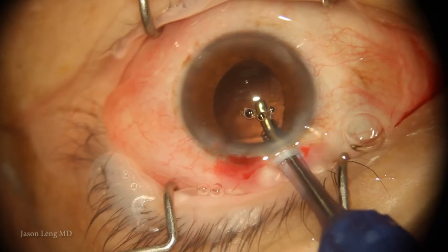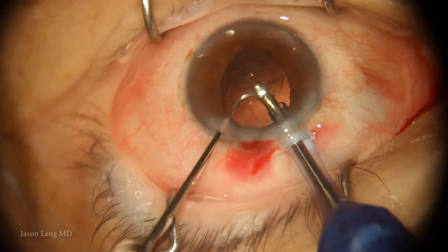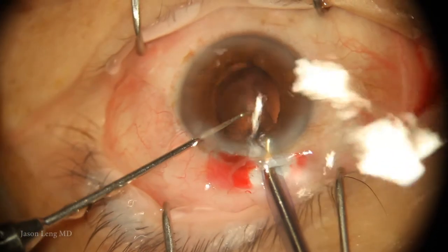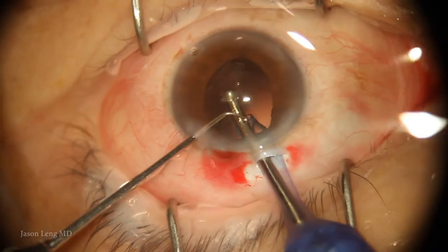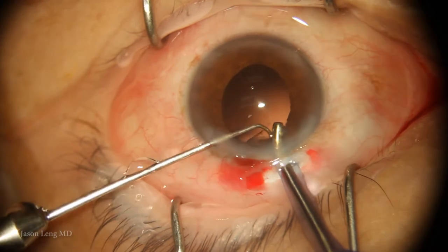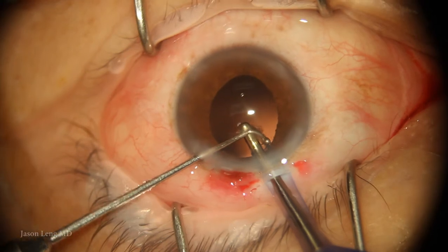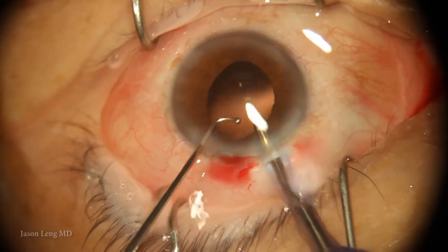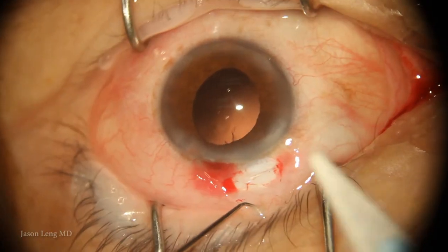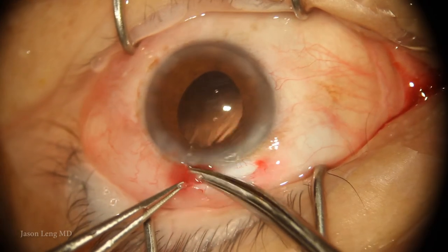So I decided to remove the bag and do a glued IOL. I'm using the IA to aspirate the bag, and it's coming out pretty easily. I just use my second instrument to help push the thicker capsule into the aspiration port. At this point the vitreous face is still intact — I'm not encountering any vitreous. I use a Weck-Cel to check and confirm there's no vitreous.